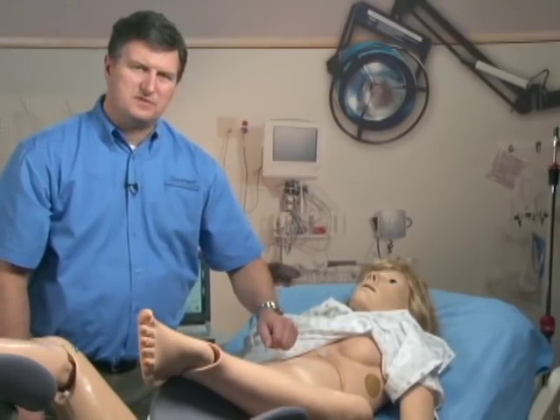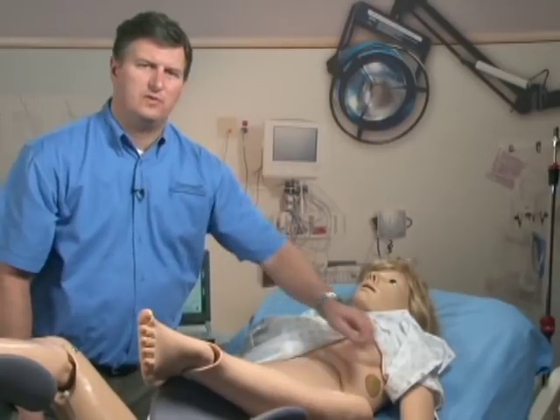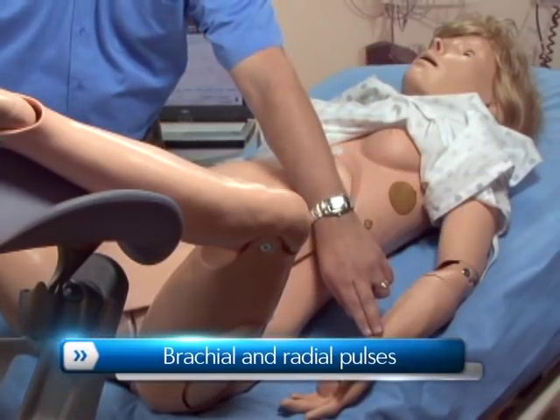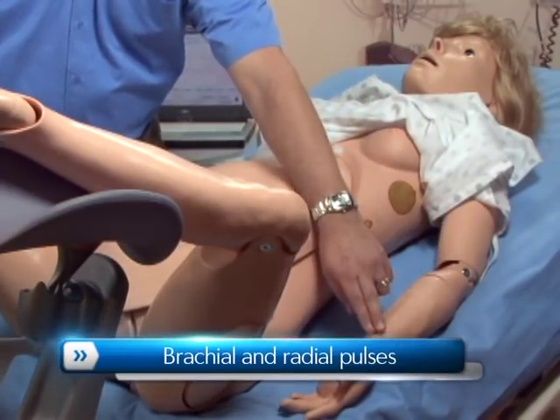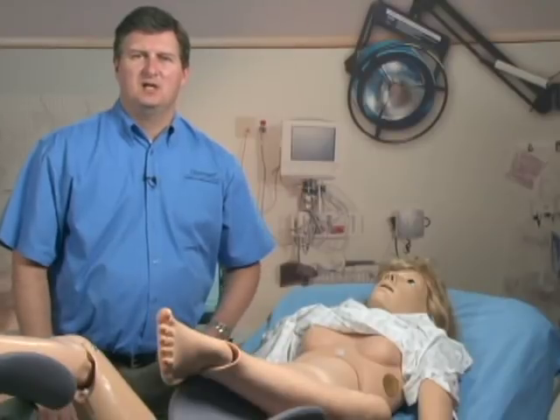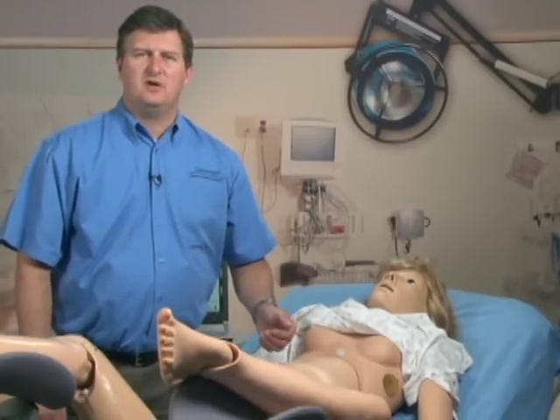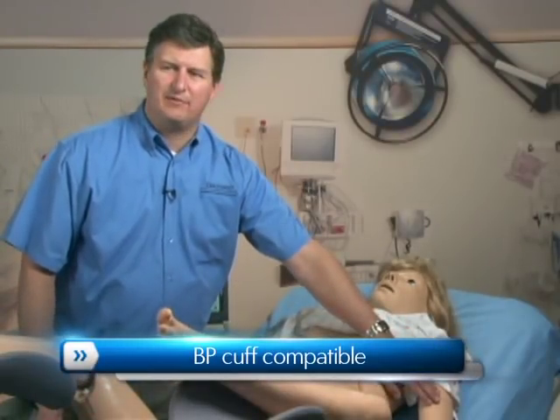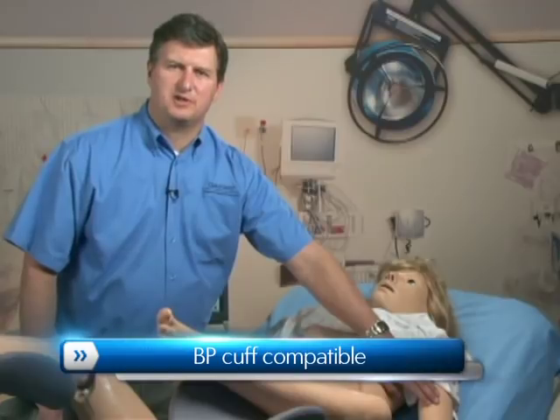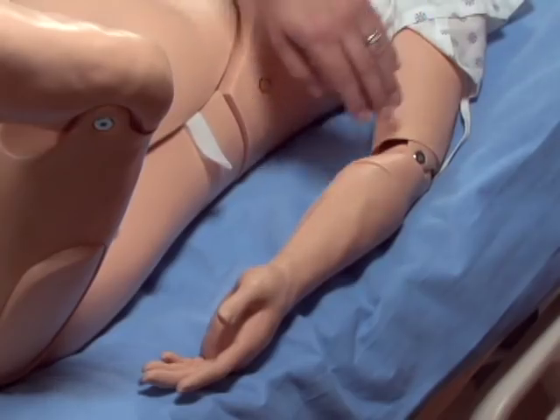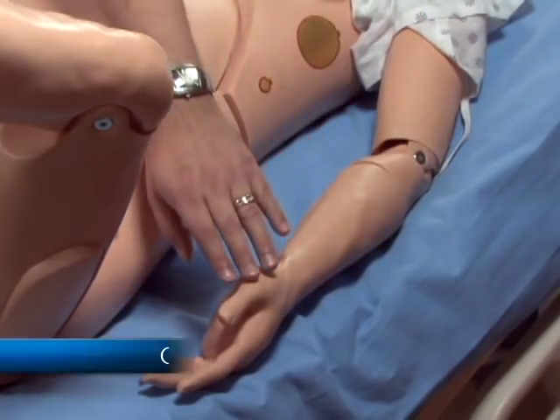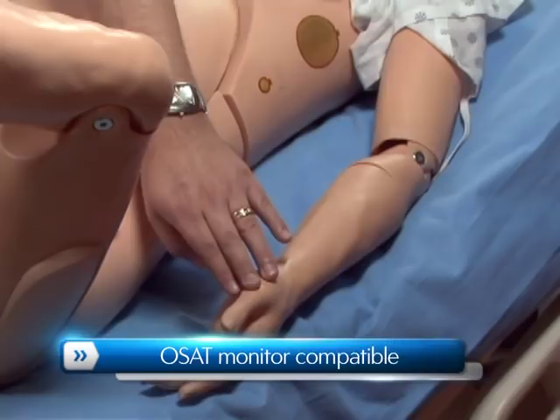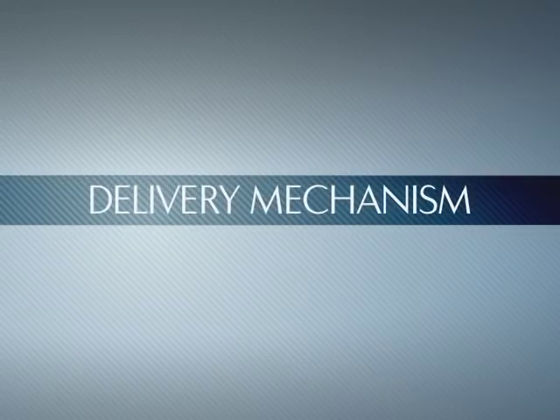NOEL also comes standard with brachial and radial bilateral pulses. You can also auscultate Korotkoff sounds using a real blood pressure cuff. And a real OSAT monitor can be used on the left index finger.